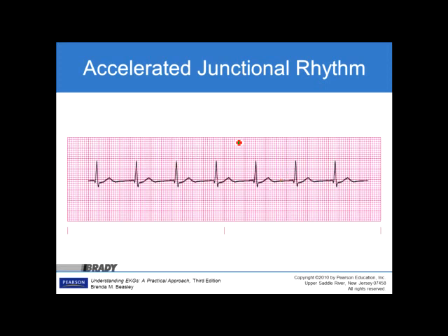Using the six-second strip method on this accelerated junctional rhythm: counting seven beats times ten gives 70 beats per minute. Step two: it is nice and regular. Step three: looking for P waves — there are none. No P waves are discernible. Step four: PR interval is non-discernible due to the absence of P waves. Step five: there is a QRS complex and it is less than 0.12 seconds. An accelerated junctional rhythm is identified by a QRS with no P waves or inverted P waves, with a rate greater than 60 beats per minute.